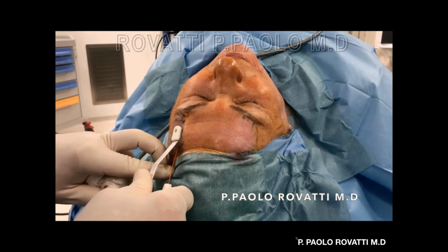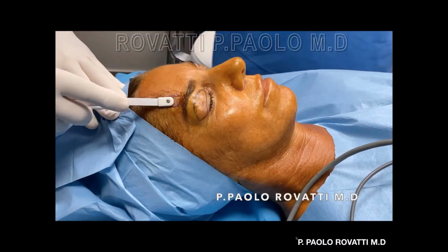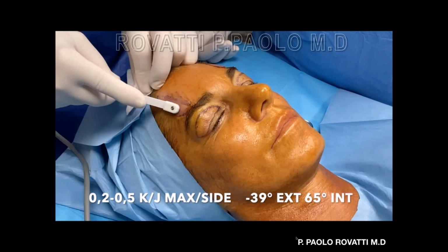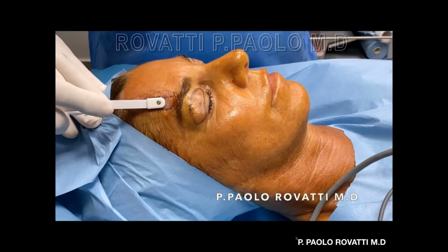This is where I'm treating. Look, I am going backwards, usually 1 or 2 lines in the same area. Don't move out of these, stay between these 2 lines that are 1 centimeter apart. Remember, the more medial line is 1 centimeter lateral to the pupillary line. And after that you have 1 centimeter, this is a good safe zone. You know, 0.2, 0.5 kilojoule maximum per side, and usually I put 39 external and 65 internal. When I'm treating, you need a few minutes to treat, and I am careful not to overheat this area. The result is during the treatment, but no problem and no complaints from the patients.